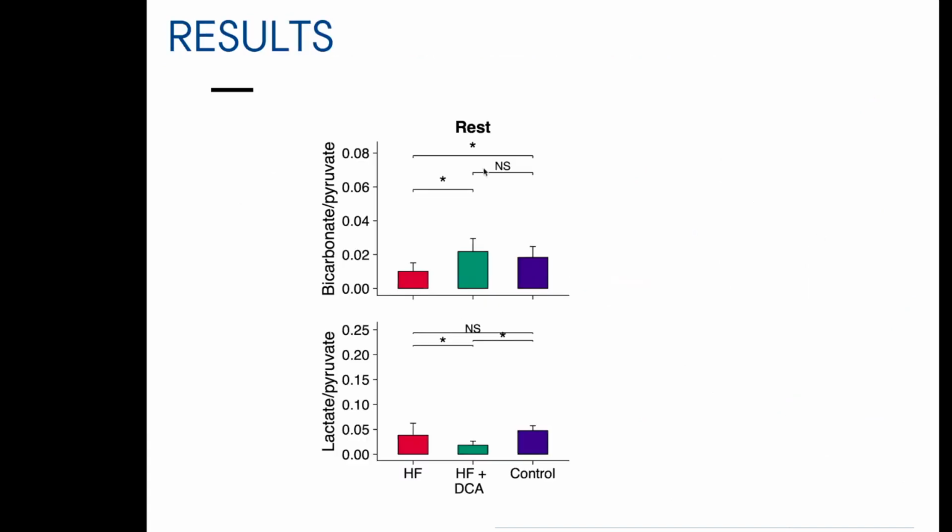And if we look at the metabolism, you can see that bicarbonate is actually increased quite a bit here, and lactate seems to maybe go down as well here.